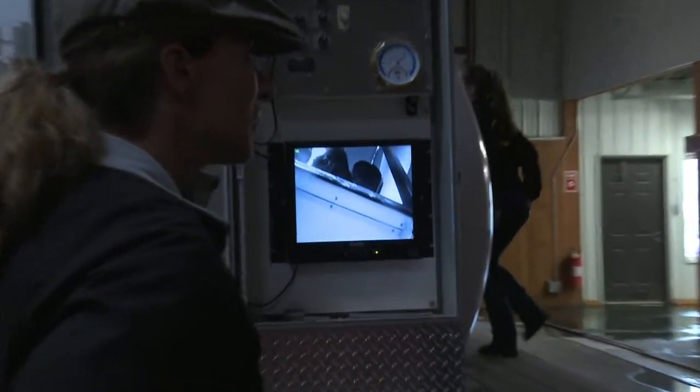Well, when horses breathe at normal ambient pressure, air pressure at sea level, they have a saturation of oxygen in their blood of 97%, which means that the red blood cells carry lots of oxygen, almost all of the oxygen that is carried by the blood at sea level is carried by the red blood cells circulating in the blood. People are using hyperbaric chambers to increase the amount of oxygen that is transported by the blood into the tissues.